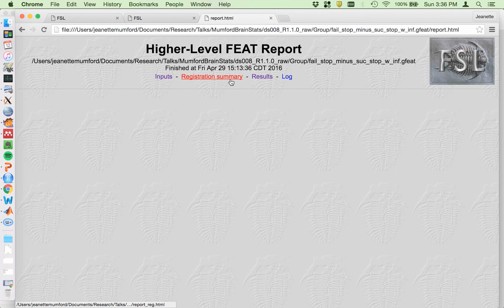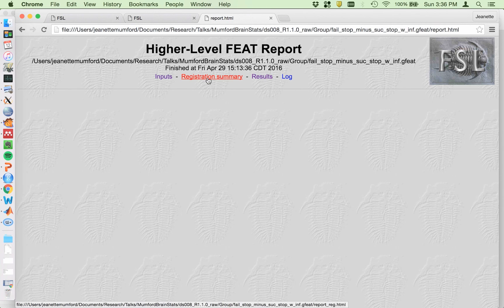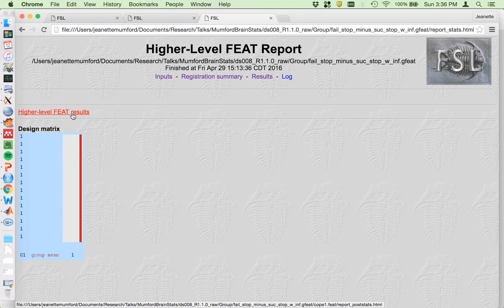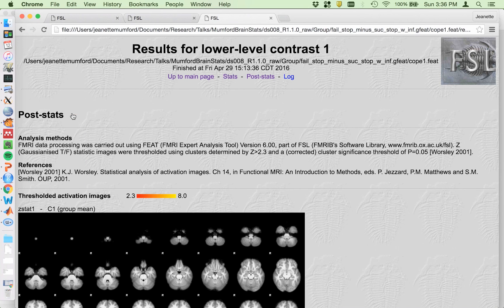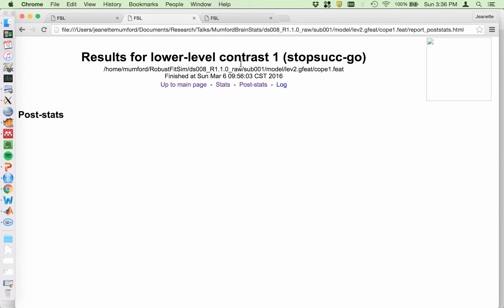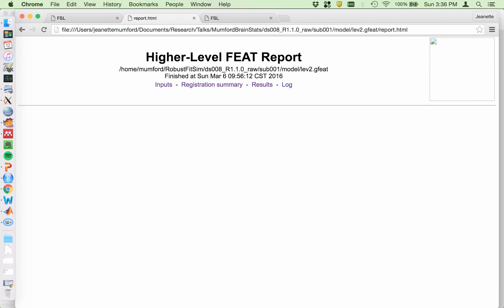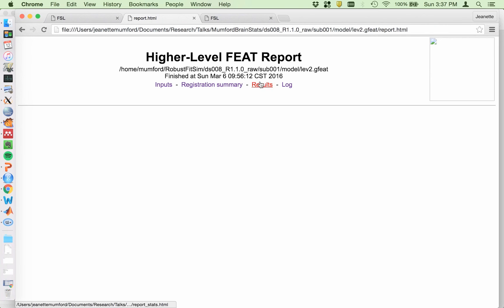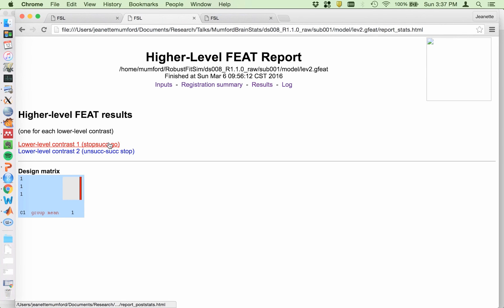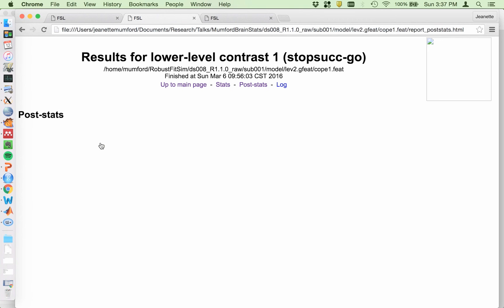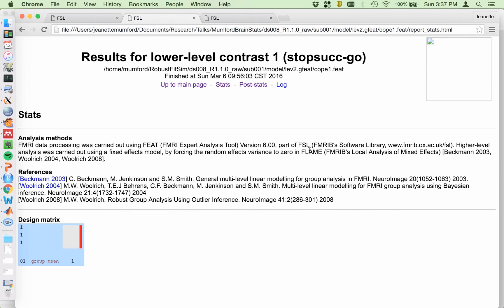So here you have to go to the registration summary. There's nothing there. So results. I need to click on a feat directory. Actually, you know what? I should have explained that better here. This was actually the report within the cope one dot feat directory. If I go, let me show you how to get there. If you start from the report in the main directory. So if you go to results, so this is just the report that's in the second level G feat directory. So if you go to results, then you have to click on one of your contrasts, both contrasts will have the same processing. So it doesn't matter, but you have a little reminder of what your design was. So you can use that to guide your description. And then once you click on that, you get the post stats and then you can click on stats. And that's where you can get the text about the fixed effects.